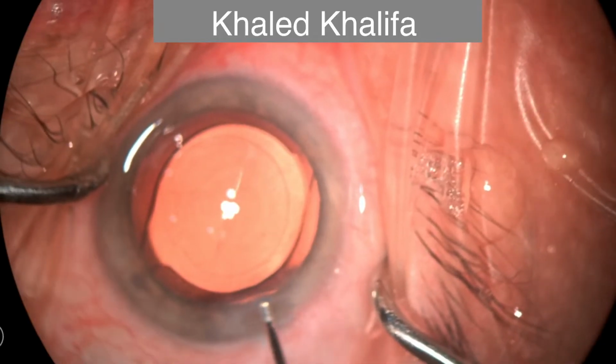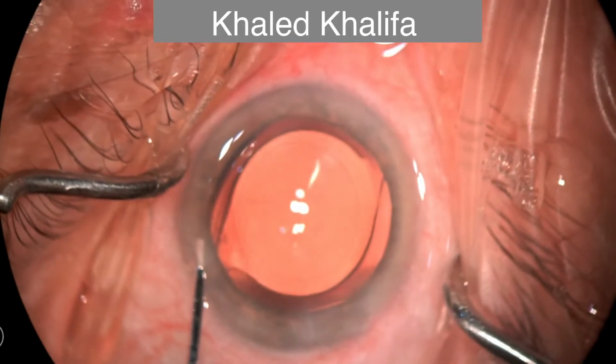Now hydration of the main wound and hydration of the side port.